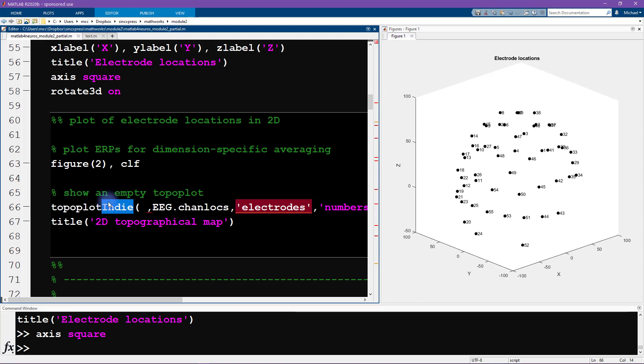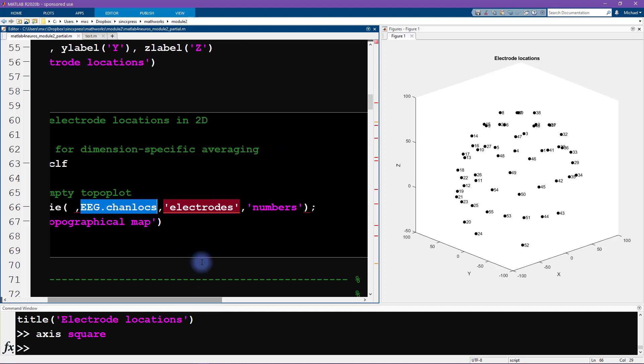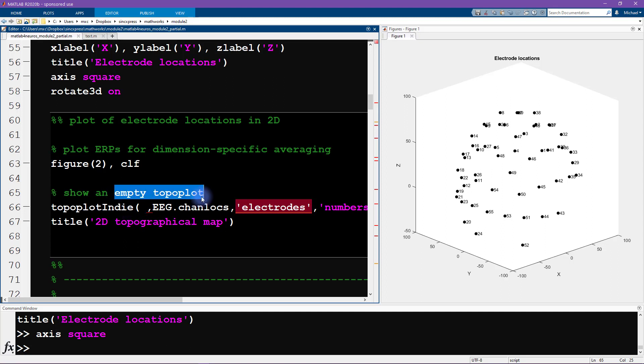So to use this function topoplotindie, we provide a couple of inputs, the most important two are the data that we want to show a topographical map of, and then the EEG channel locations. We have a couple of other extra optional inputs here. In particular, I'm activating, I'm showing the electrode numbers. Now, we don't actually have any data, we haven't yet analyzed the data or done any spectral analyses. So we just want to show an empty topoplot.